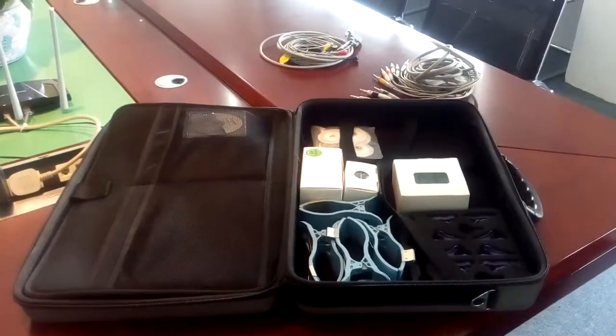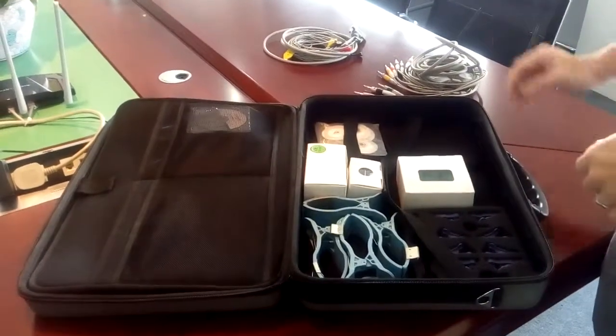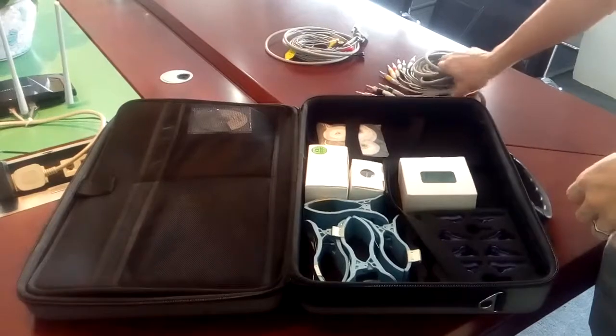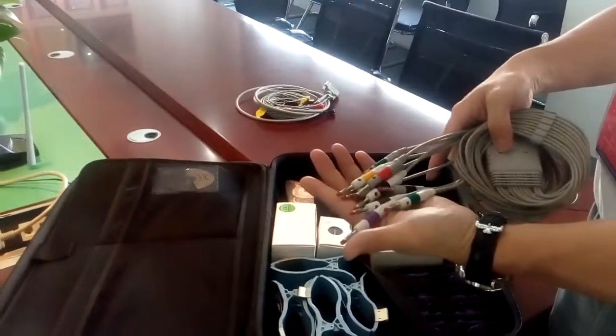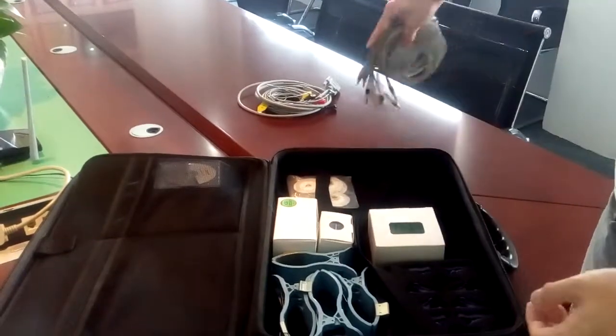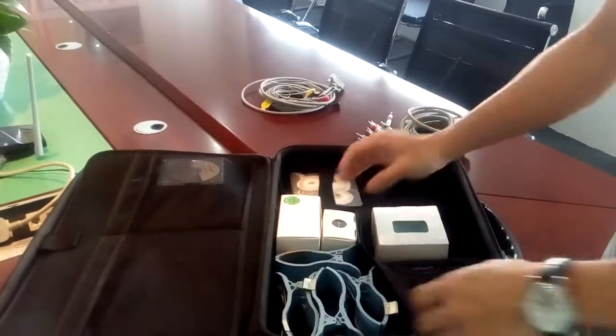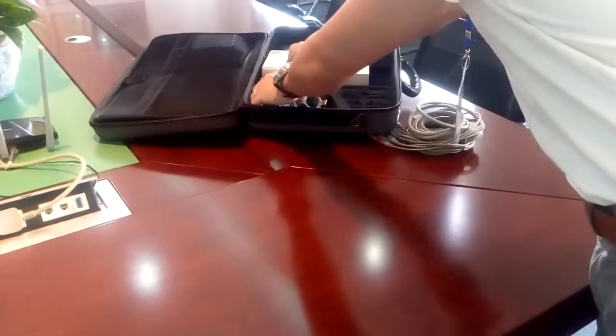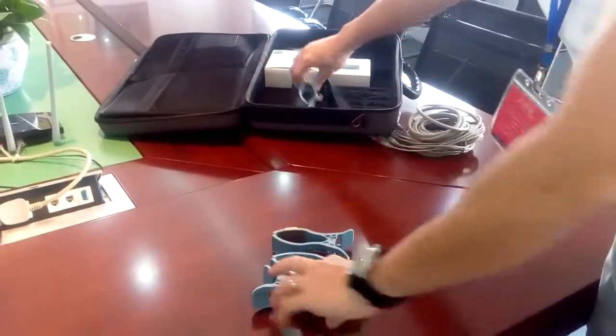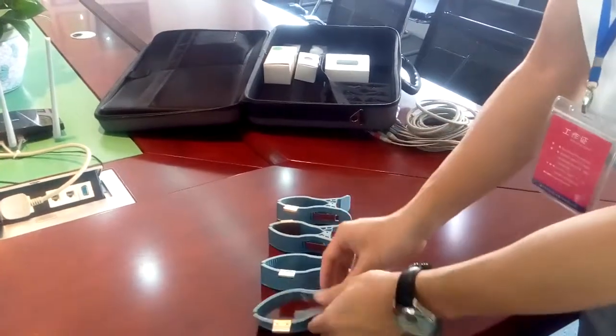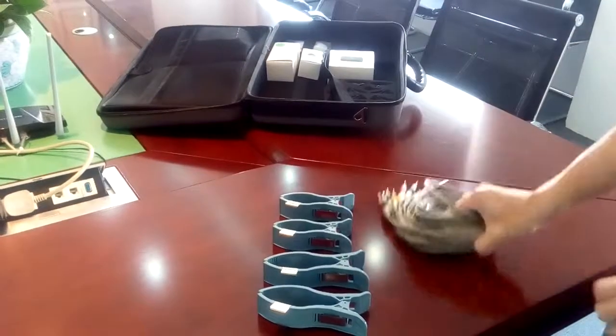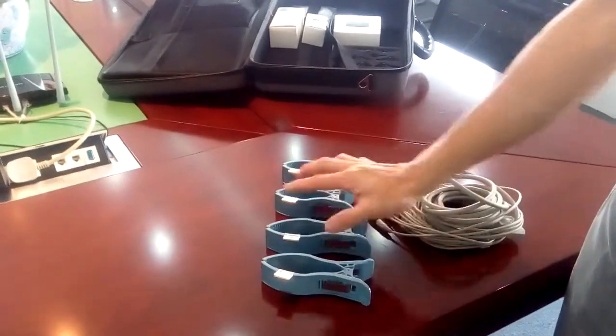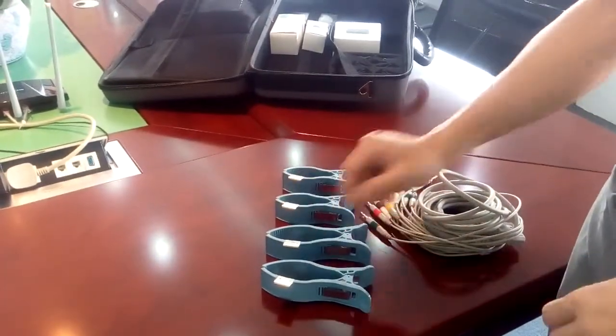When you get the ECG from CareWell, in the standard accessory box you will have this patient cable with the banana head and four different clamps. These four clamps are for adults.